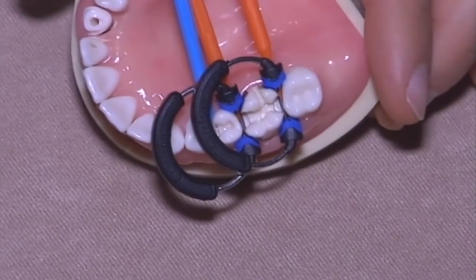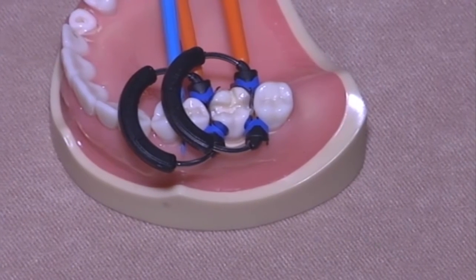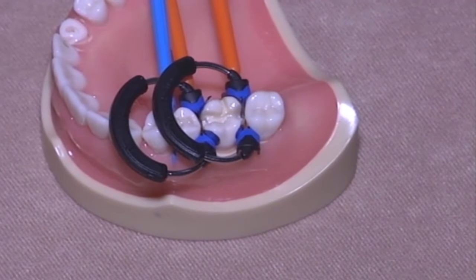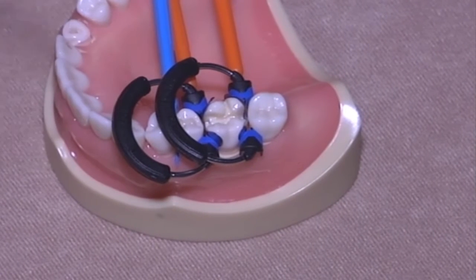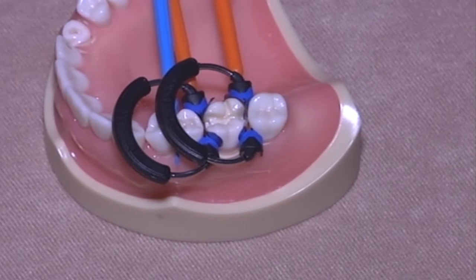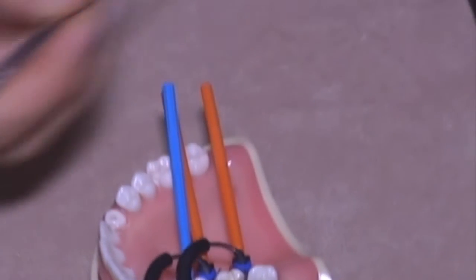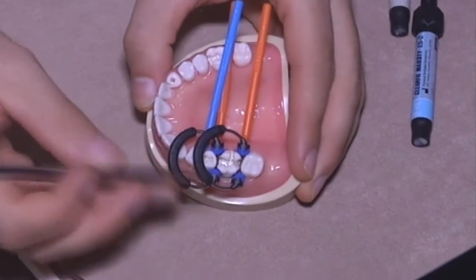Okay. In this case, you can even apply both this one and this one. You can even apply both the rings, and you see that you can easily go inside the cavity to build up the interproximal wall.